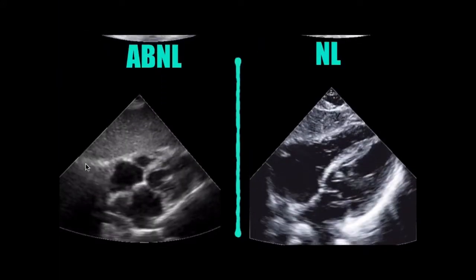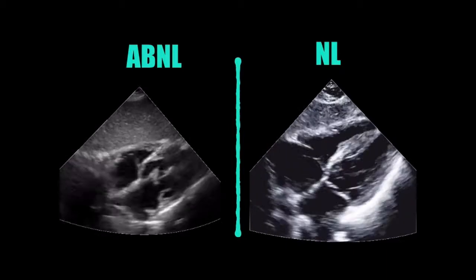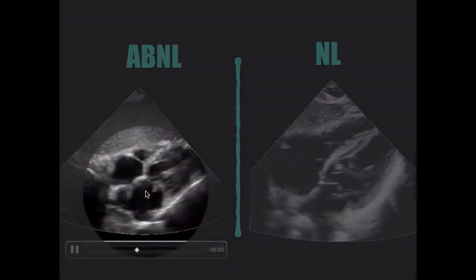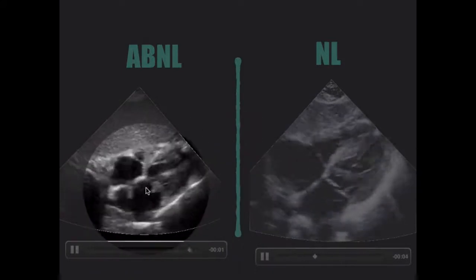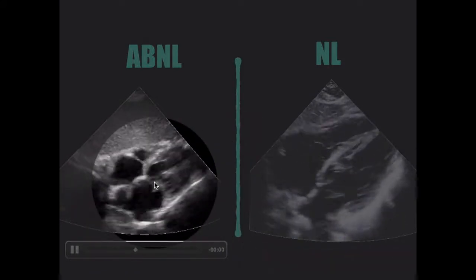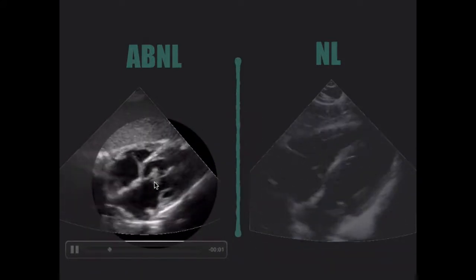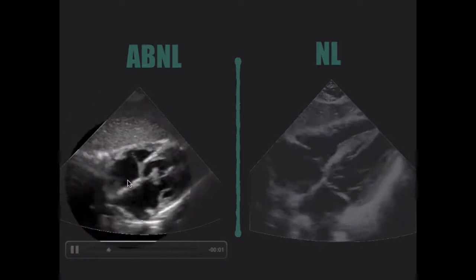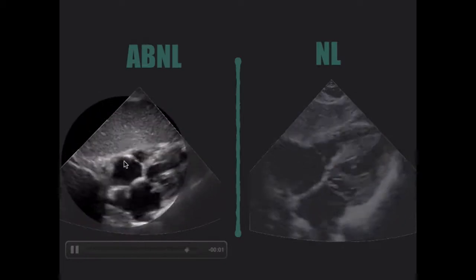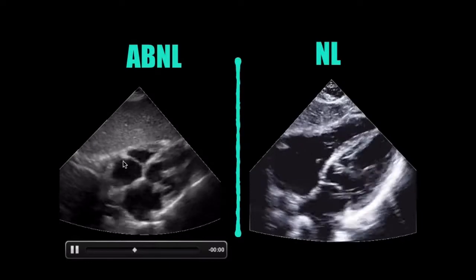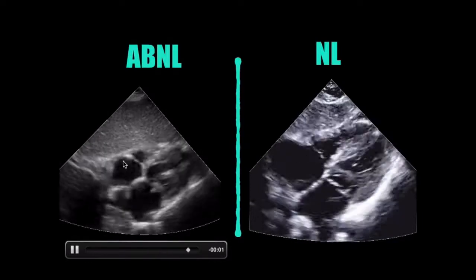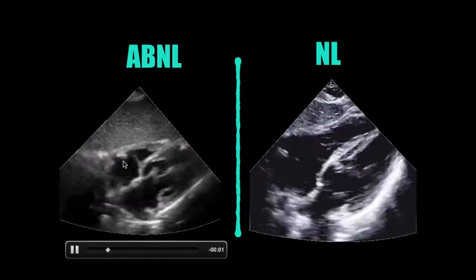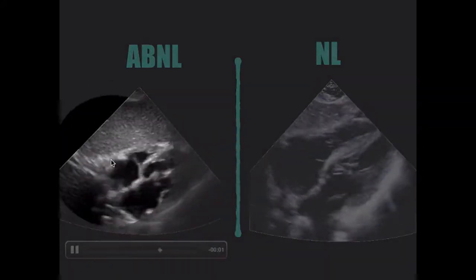This is a sub-xiphoid view. Where's the vegetation? Mitral valve, exactly. Right here this is normal, this is abnormal — you see that little booger right there? That is a mitral valve endocarditis. You see that bright thing right there that's causing that weird artifact below? That's just a little calcification. You'll see that on valves — you'll see shadowing behind it. That one over there is not endocarditis, but this guy right here is.